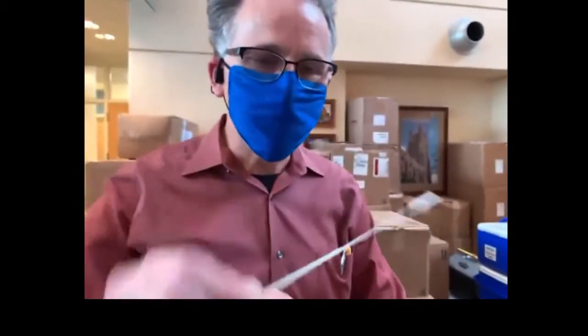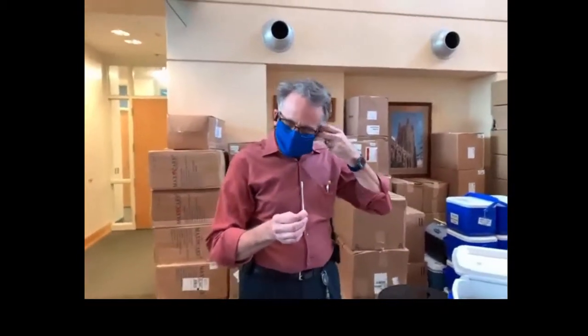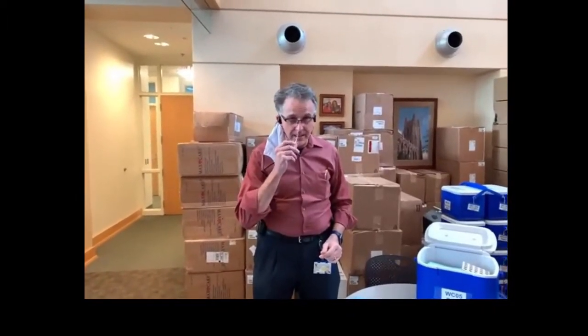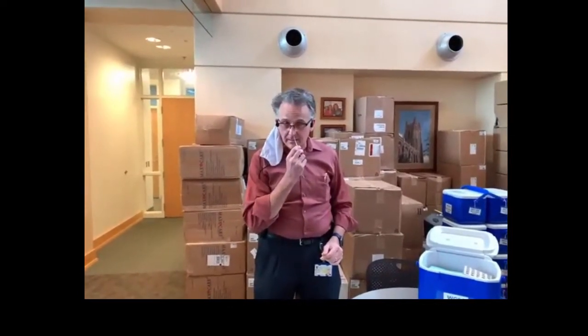I'm going to take my mask off now. So what you want is for the student to insert the swab into their nose and then turn it around three times. Take it out, put it on the other side, and turn it around three times.